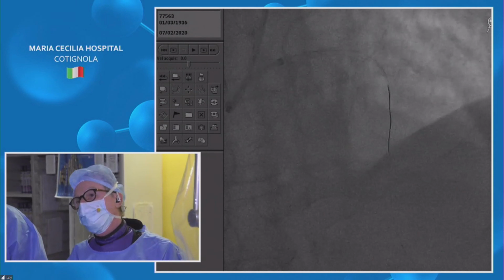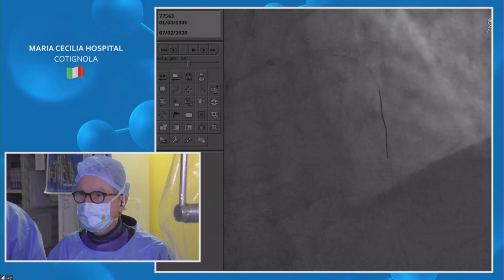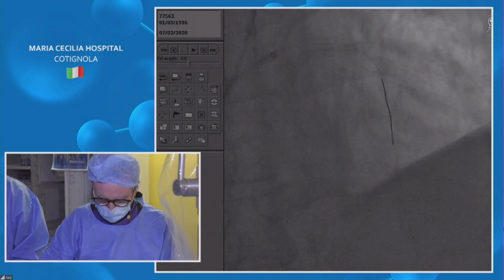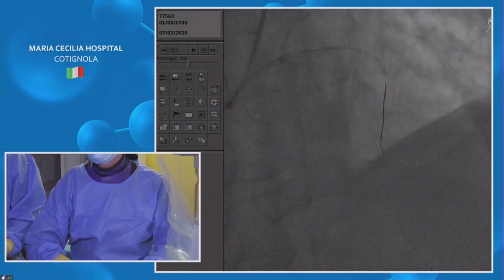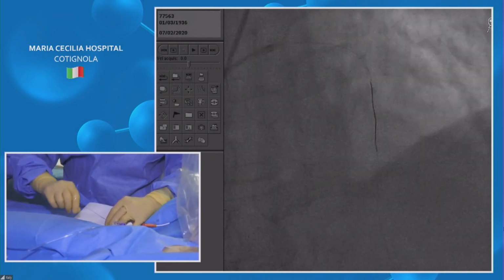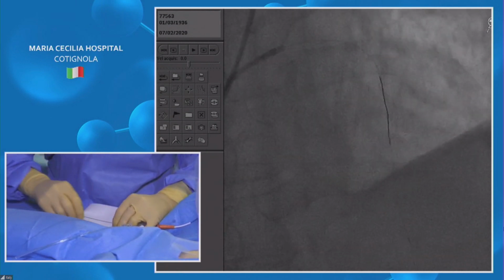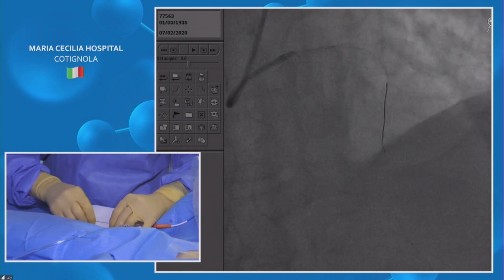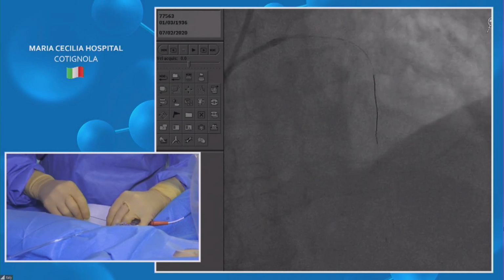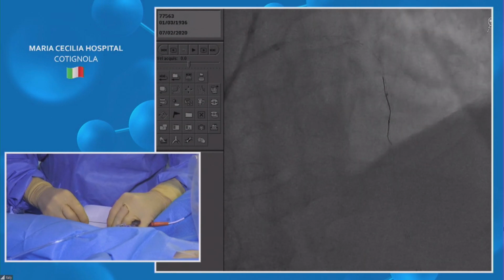So our stenosis now is in the mid of the radiopaque pressure wire. This is a trio non-compliant balloon, which we will use to predilate this lesion. Any other questions? I like to use this pressure to avoid long stents, because if you can avoid implanting a very long stent, that's better. So here we are, we said in the mid, we can inflate.